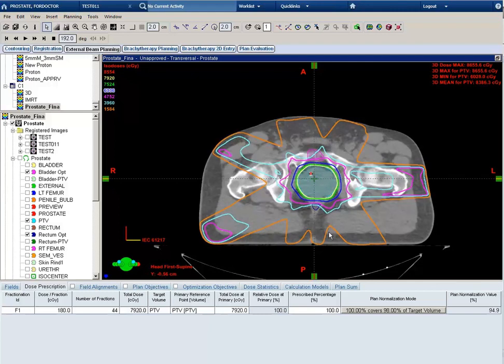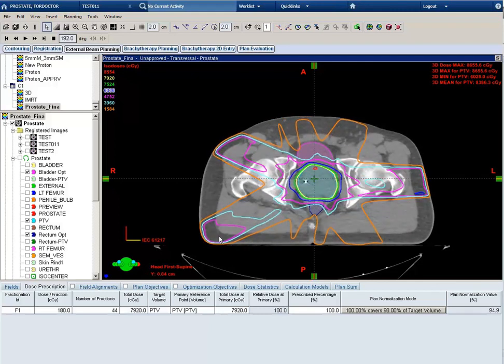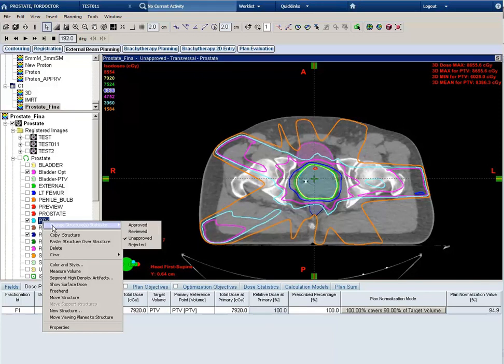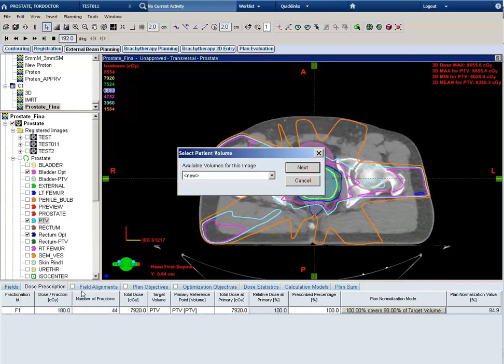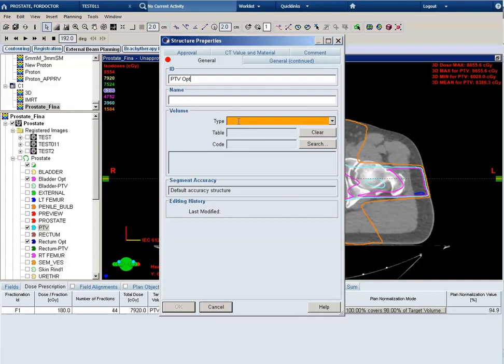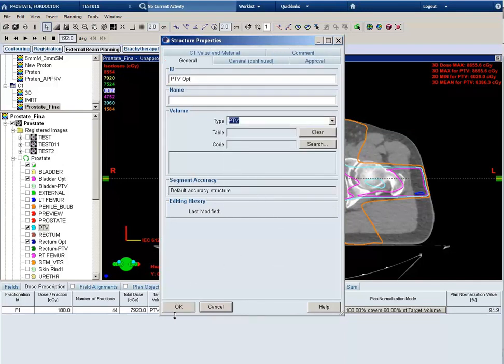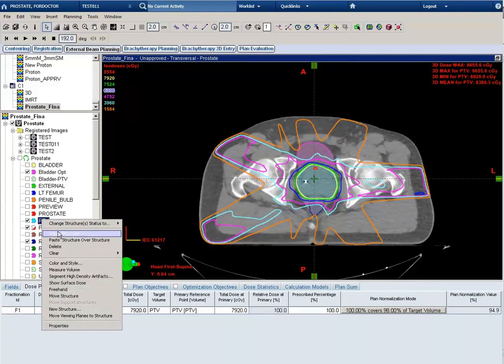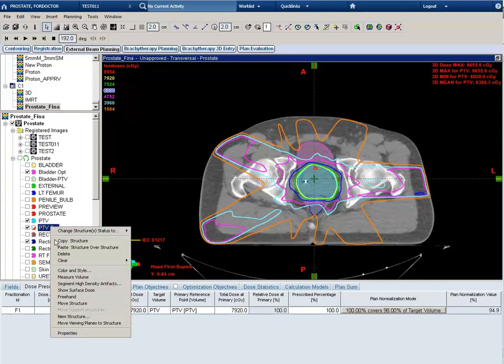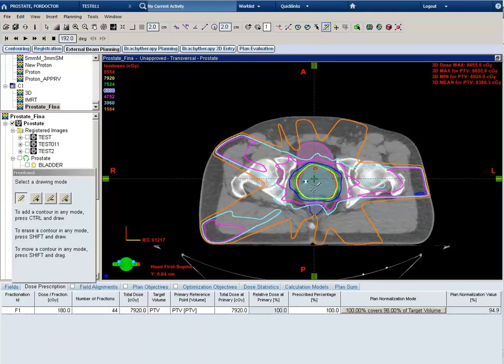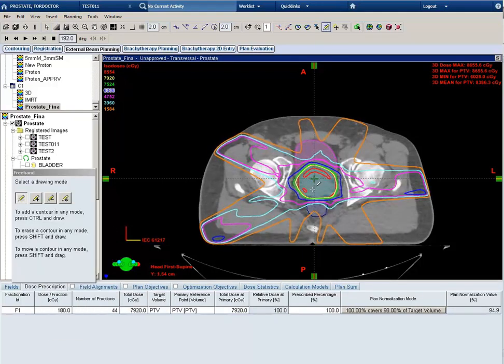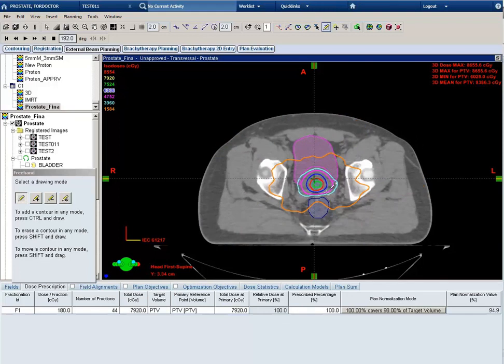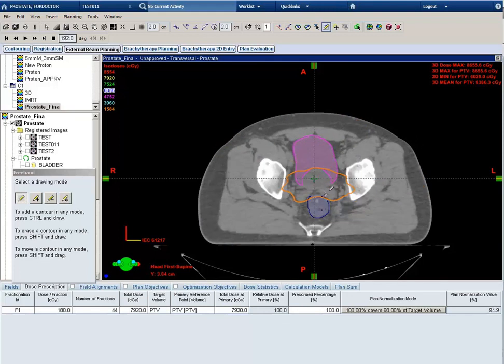So in order to improve our coverage superiorly, I'm going to go ahead and create a PTV opt contour. So I'll right mouse, new structure, and I'll call this PTV opt. In the type I'll select PTV and say OK. I'm going to right mouse and copy the PTV contour and right mouse paste the PTV contour under the PTV opt. This creates a PTV contour in the PTV opt.